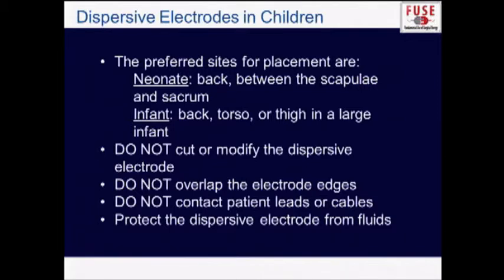But in the smallest folks, and in all children, all of these sites are going to be at risk for pooling of fluids, either from your skin preparation, drainage from your operative site, or irrigation during the procedure. And of course, you have to consider that in adult surgery also, or surgeries where you're going to be using a lot of irrigation, or have a lot of fluid in the abdomen, but it's really important in children.